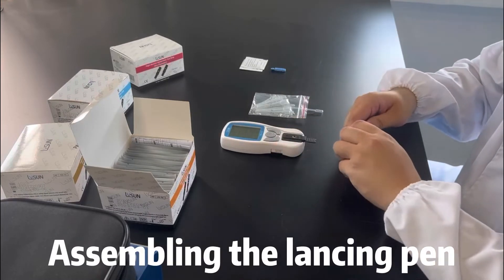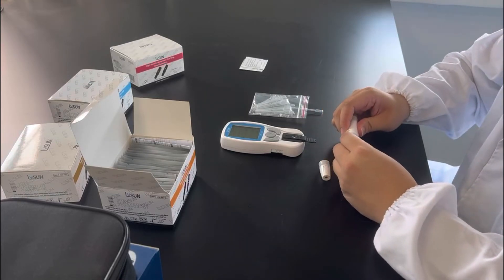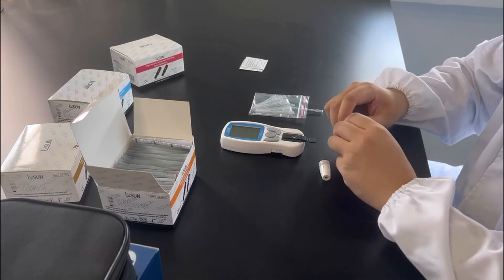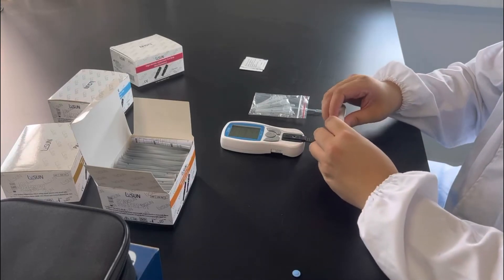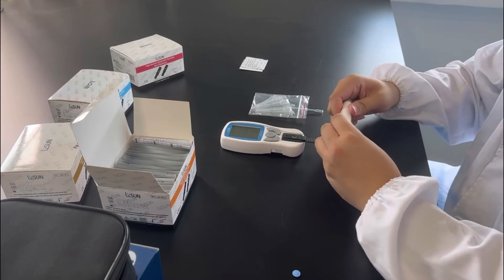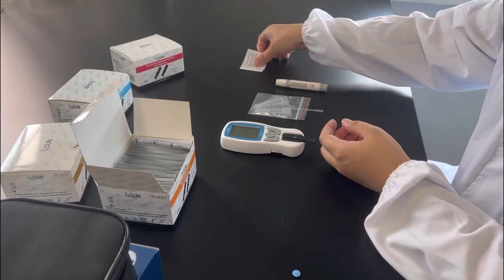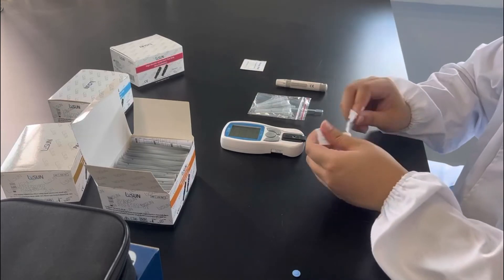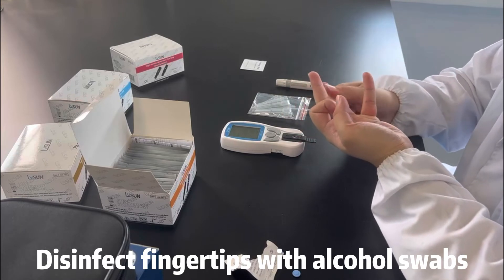Assembling the lancing pen. Disinfect fingertips with alcohol swabs.